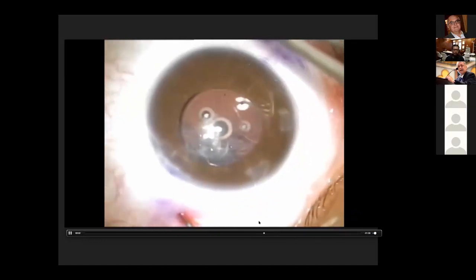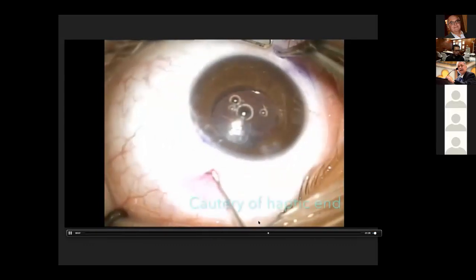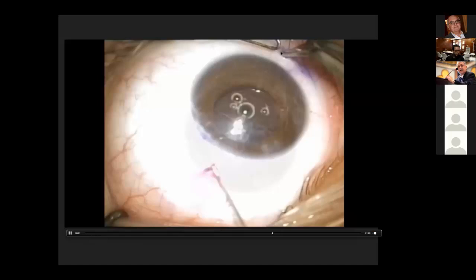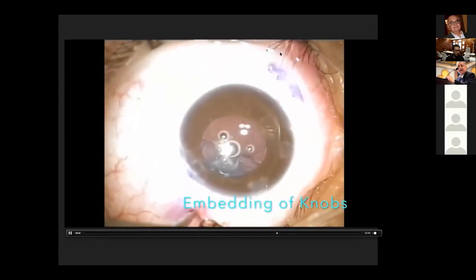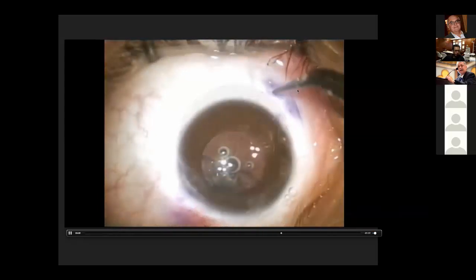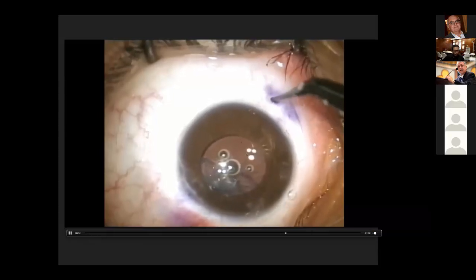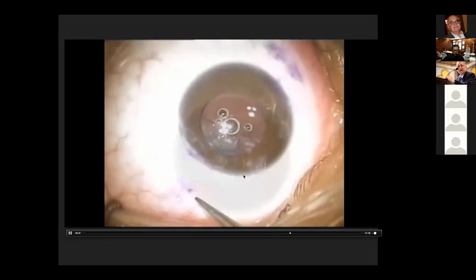Now, by manually manipulating the lens in position, the lens is secure. You cauterize to make a knob so as not to have this tip slipping back again inside the sclera, and to be able to embed it in the sclera tunnel. So now the situation is the lens is properly fixed but we still have the phimosis.